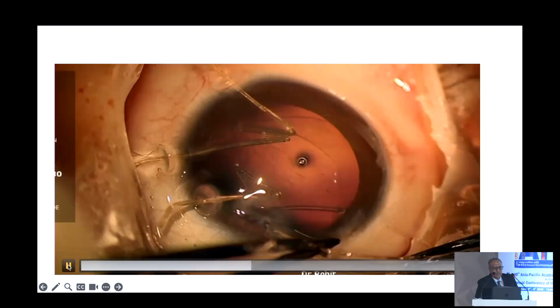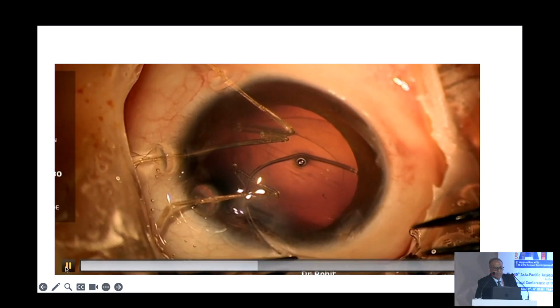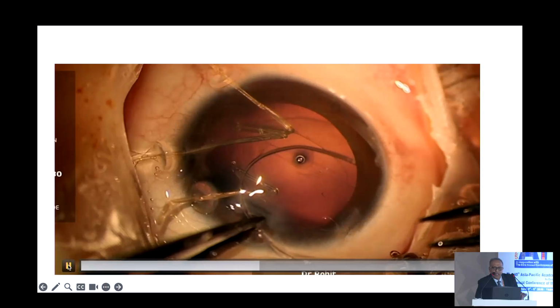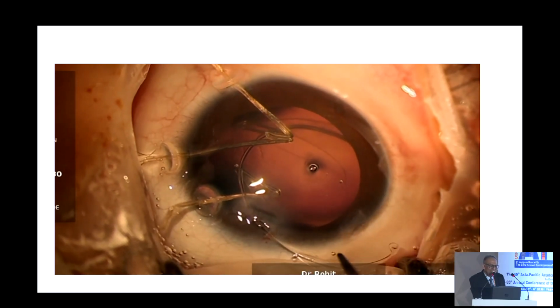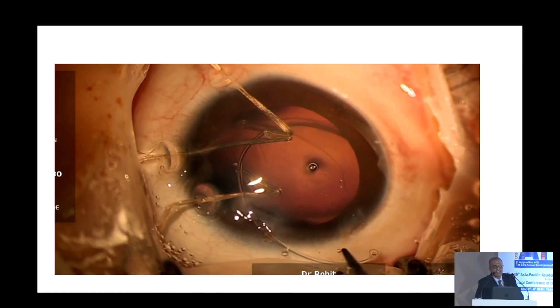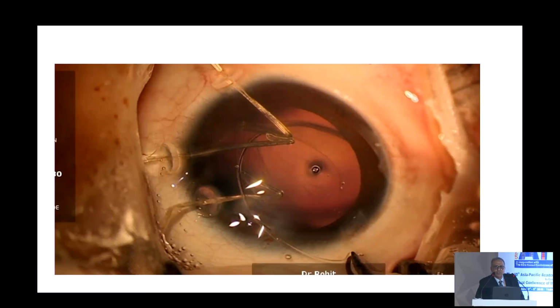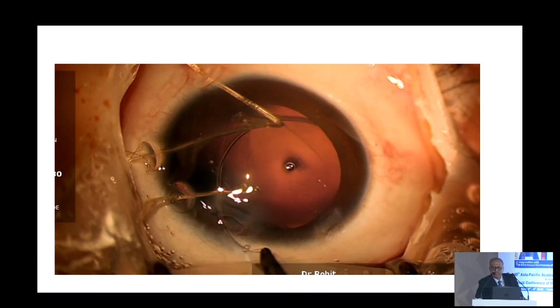So now once that is done, CTR is being pulled in. I would have preferred that this CTR should have gone like this. So it is going in like this. Dr. Chi, is it okay if I continue like this? Yeah, no issue. But in your hands. But yes, for novice surgeons, you should ideally do it the other way around. And how do you see that the capsular hooks don't come in the way in such a situation? I think it's a different plane that you're inserting it, so it really doesn't get engaged. It doesn't make a difference.